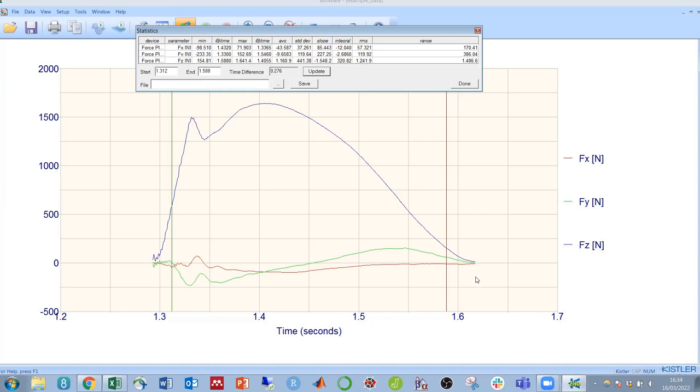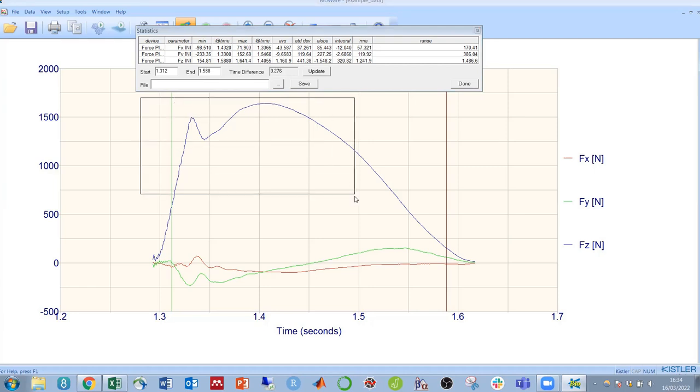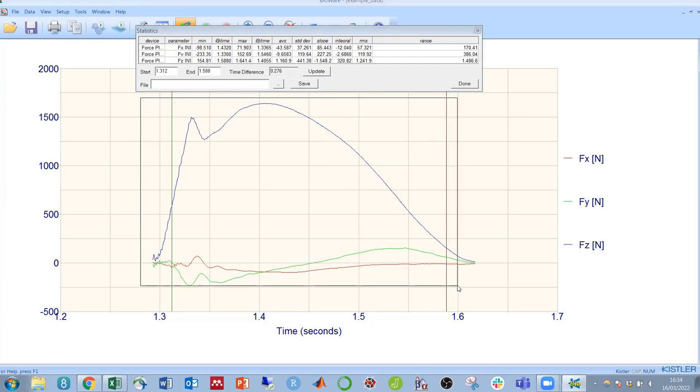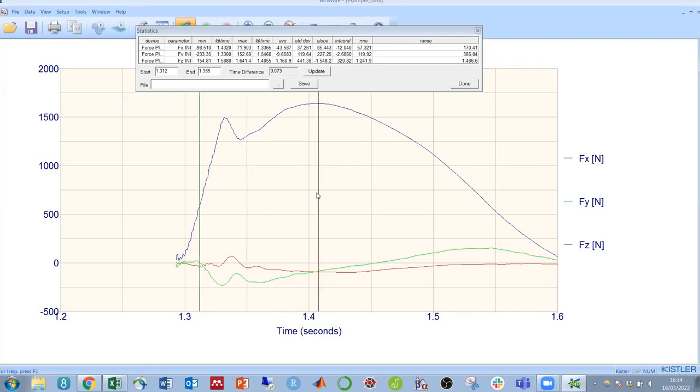We can also zoom in to make these timings more accurate. If we right click and draw a box going from top left down towards bottom right, it will zoom in, and we can then move to get these lines more accurate.